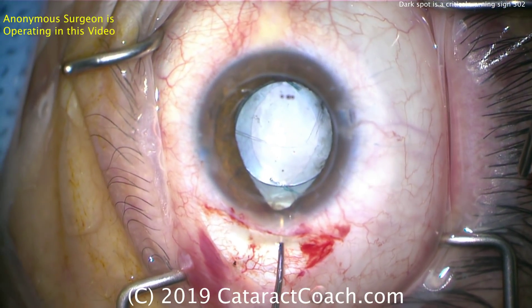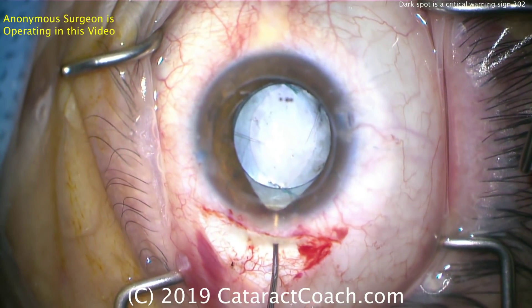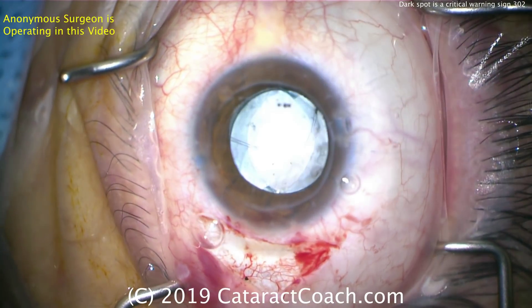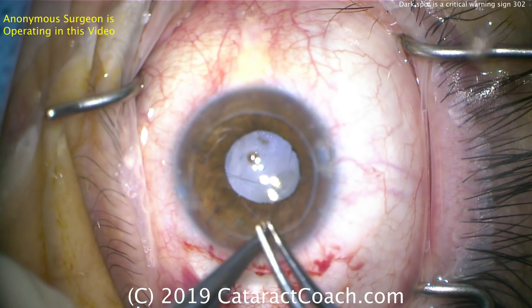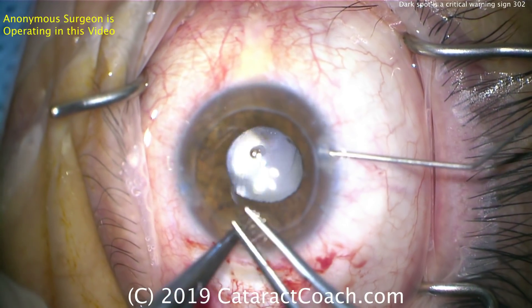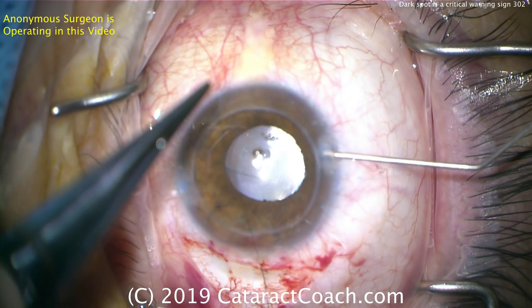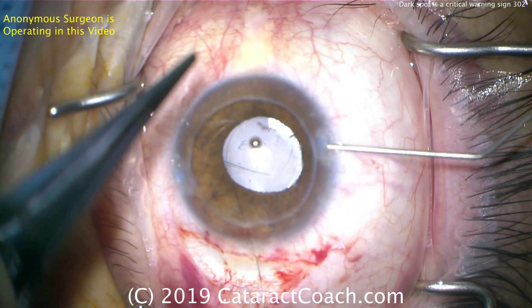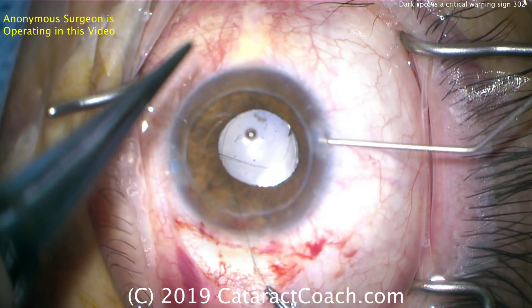I have no doubt this patient is going to have a nice outcome. Yes, it'll take another procedure — a vitreoretinal procedure to remove the lens material from the vitreous cavity — but that's okay. I applaud the surgeon here for doing a good job. And here at the end, placing a suture in the incisions too. This patient's going to have a nice result. You can see the pupil is round and the anterior segment is free from any vitreous. Thank you for submitting this video, and I trust that you've learned a lot.